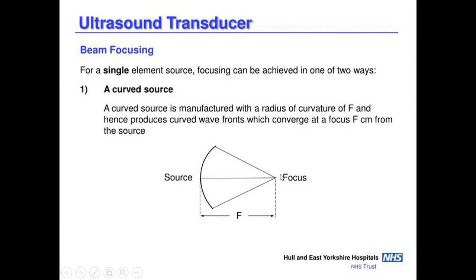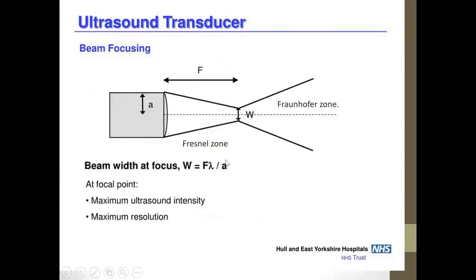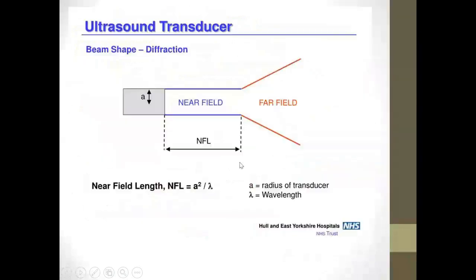All right, in order to enhance the focusing present in the beam, we need to understand that this focal zone is the area that has more homogeneity for the beam, the area that has higher resolution. So, he wants to capture images in this area. How will he achieve this focusing? This is what we will discuss next time, God willing, how beam focusing is done.